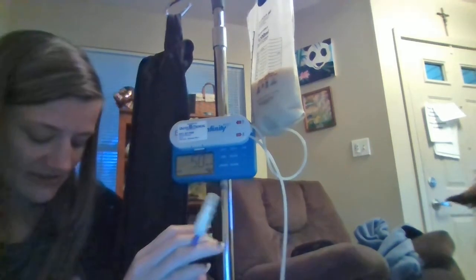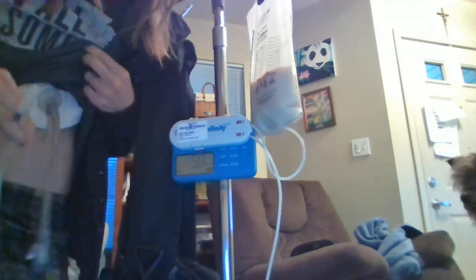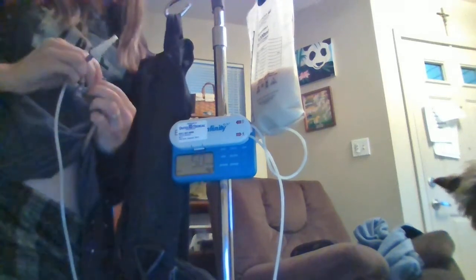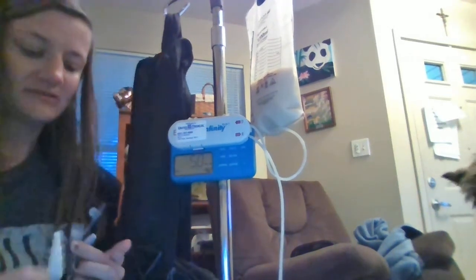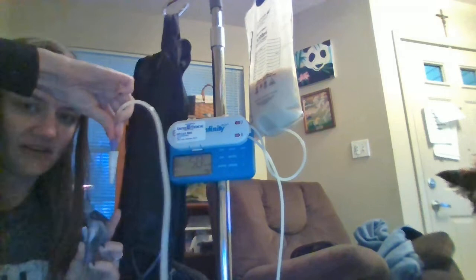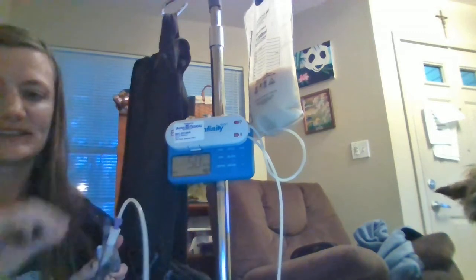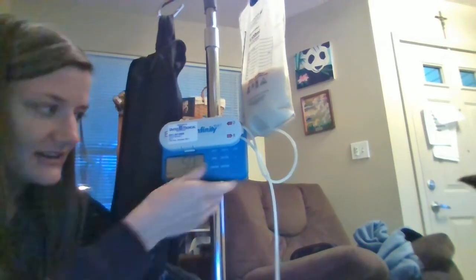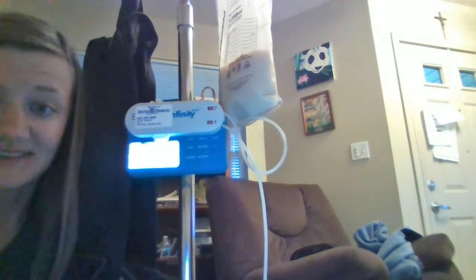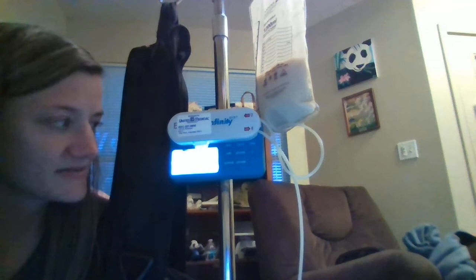And so since it's primed, what I'll do is get my tube, which is right here. It's connected. I have gauze around it. Sorry if that's gross to you, but it's my reality. I will open the cap from this. I wait till it sinks down so it doesn't overflow. And then see this right here, the tip goes into here, which is my jejunum, which is the small intestine. See? And then all you do is press run. And now I'm being fed in my small intestine. So that is how you do that. It's pretty easy. It did take me some time to get used to.